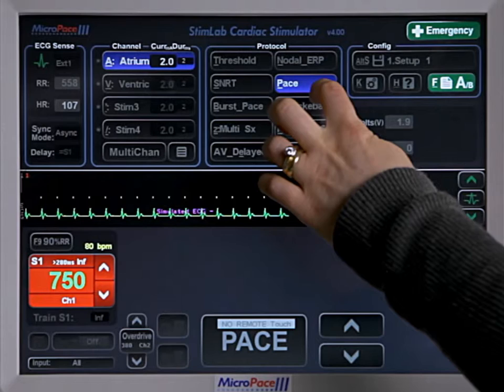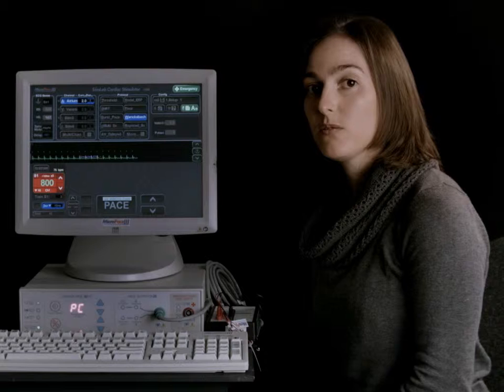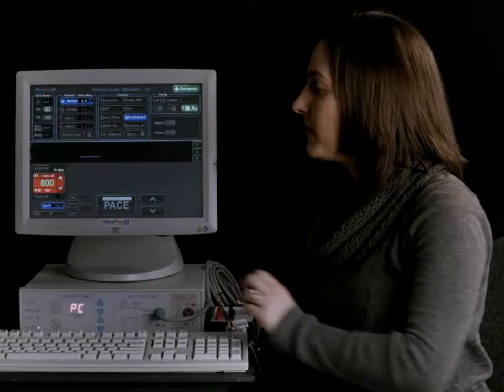Now let's have a look at the Wenckebach protocol. This will start an S1 of 800 milliseconds and then have an ever decreasing S1. This is where you're looking for AV block, both in the anterograde and the retrograde conduction, depending on whether you're using the atrium or the ventricle to pace.